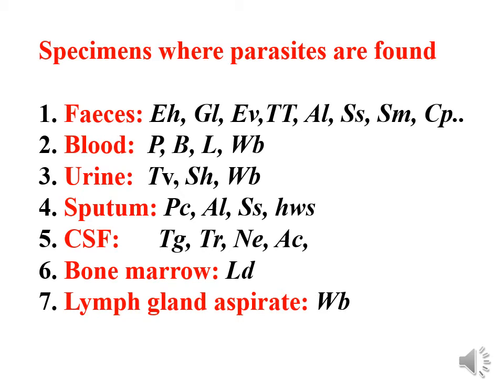In the blood, usually the most important parasite is Plasmodium, causing malaria. For Plasmodium, there are 4 species which you know, which are falciparum, vivax, ovale, and malariae. There are other minor species, no need for them now. Then this is known as Babesia microti. Usually it is a parasite affecting animals, transmitted by hard body ticks. However, human infection can happen. The parasite in the red blood cell resembles Plasmodium.